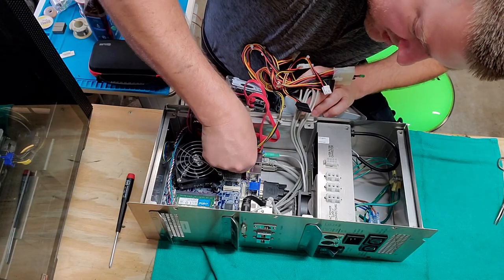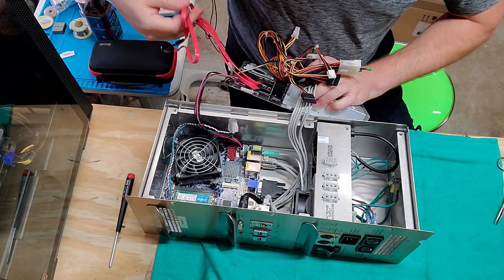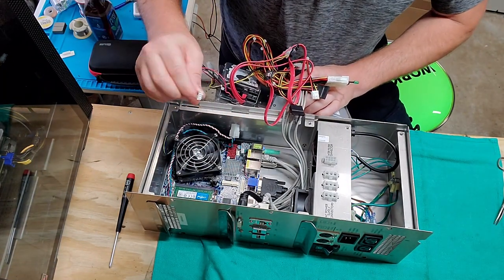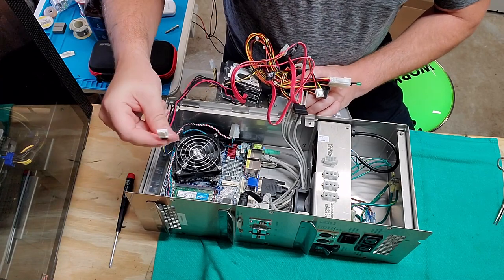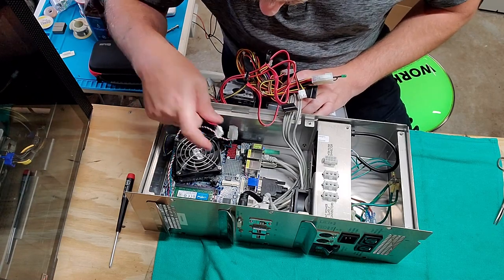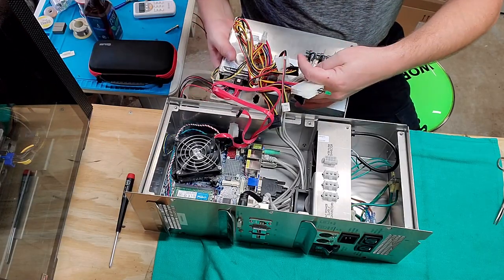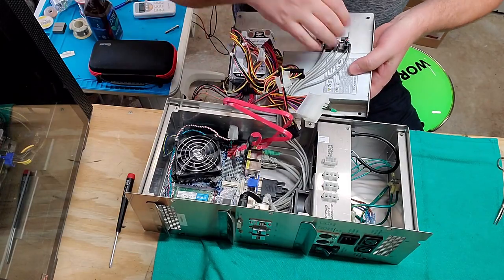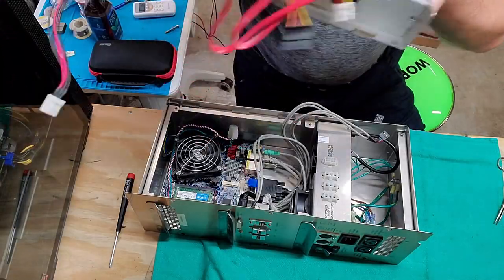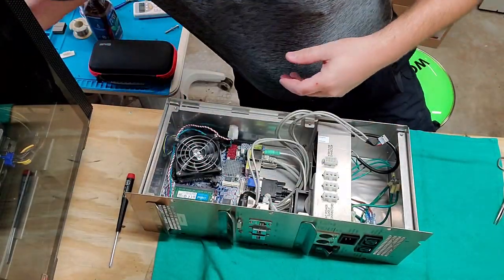And so this one's not that old, because I've got SATA connectors for the RAID. And let's see. All right, they got a little custom solution right here for the power on those SATA drives. That's interesting. This is like the old floppy style connector, but they've got that plugged in there. Oh, this is all kind of custom. All right, and the USBs, I'm just gonna go ahead and disconnect the USBs. They should just pull off. And they're all labeled. So USB, USB, USB. And we're gonna go ahead and take that top panel and put it off to the side.